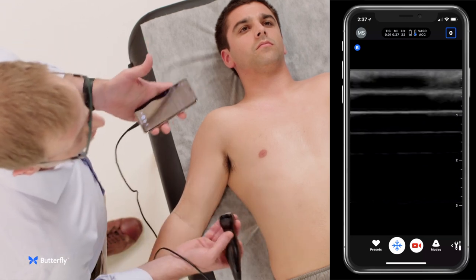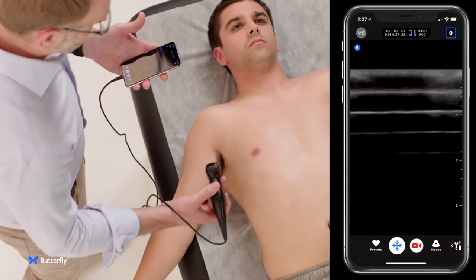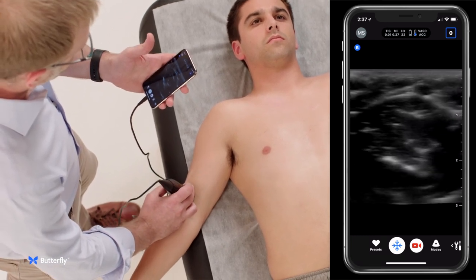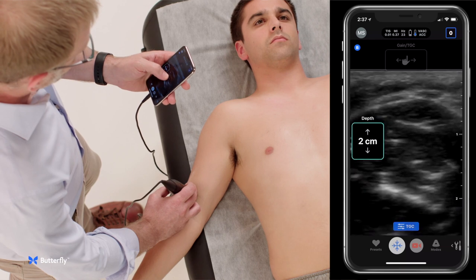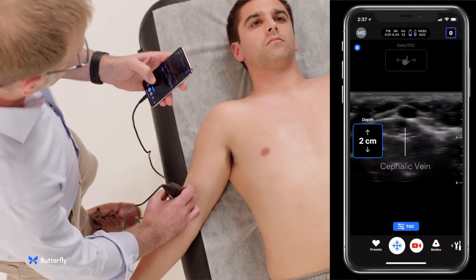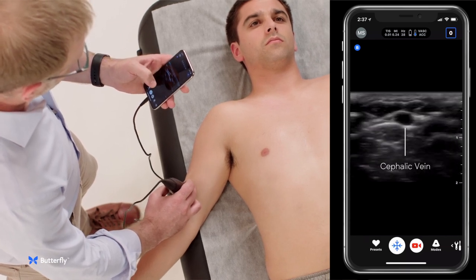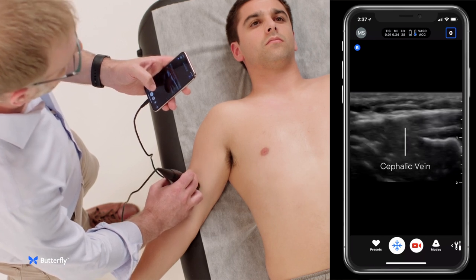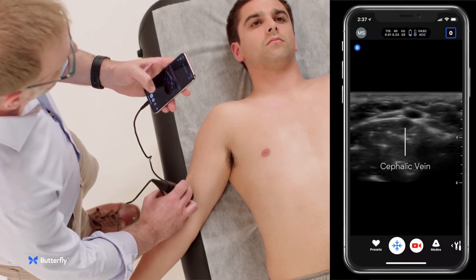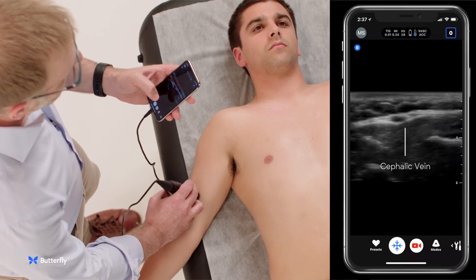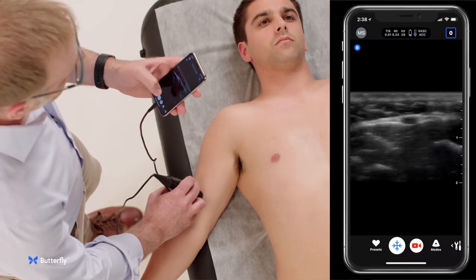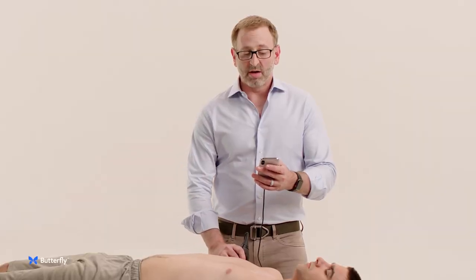An alternative approach would be the cephalic vein on the other side of the arm, still in a transverse orientation — very superficial above the muscle. Here you can see the cephalic vein in the near field, compressible. You can follow it up and find a location where it runs in a straight line, doesn't really turn much from left to right on the screen as you scan up and down, and use that as an appropriate target for IV placement. Either of those approaches can help find a good IV in the upper arm using the IQ.